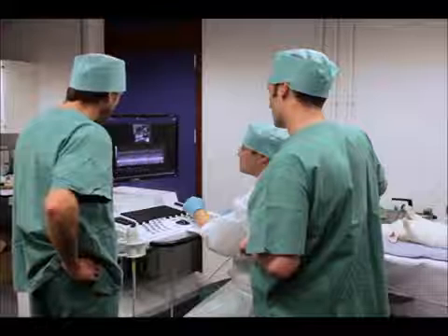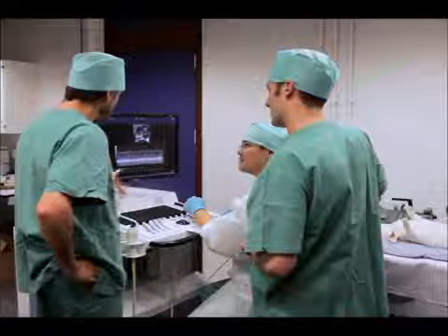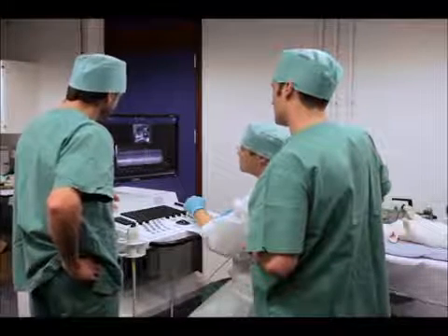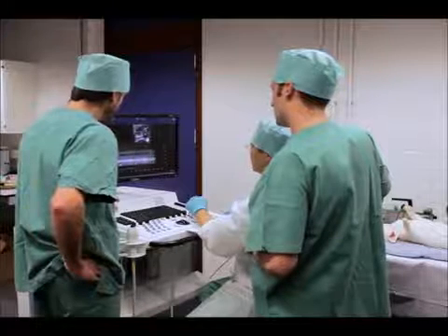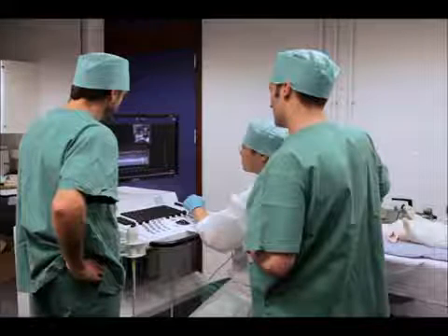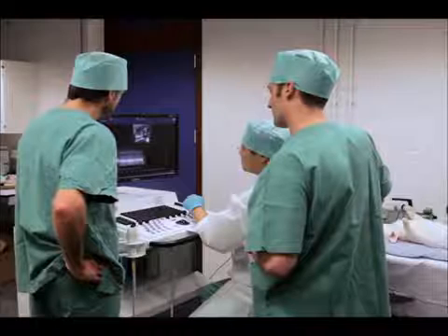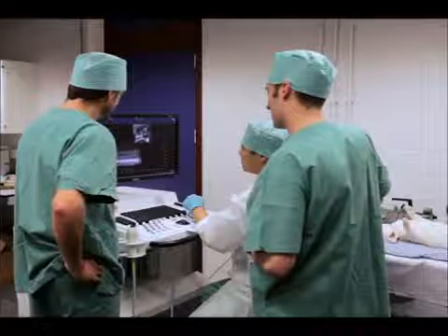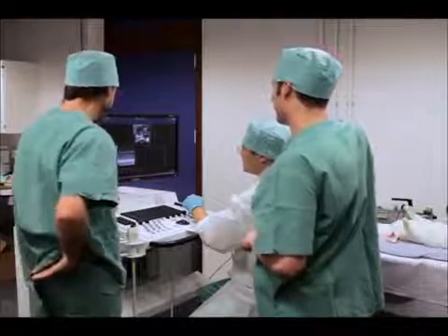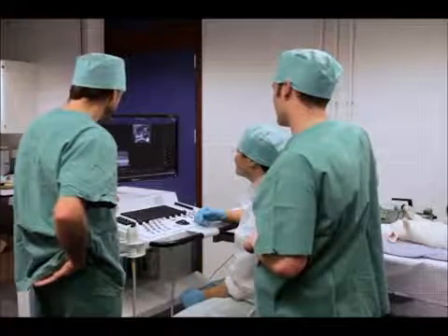It has a center frequency of 21 MHz with a bandwidth of 13 to 24 MHz. The geometric focus is 15 mm, the maximum image width is 23 mm, and the maximum image depth is 30 mm. The footprint is 28 by 5.75 mm. Data is acquired in accordance with the American Society of Echocardiography guidelines and standards for performance of the fetal echocardiogram.